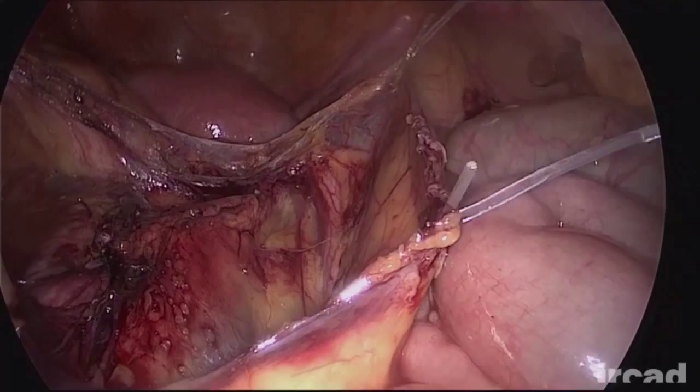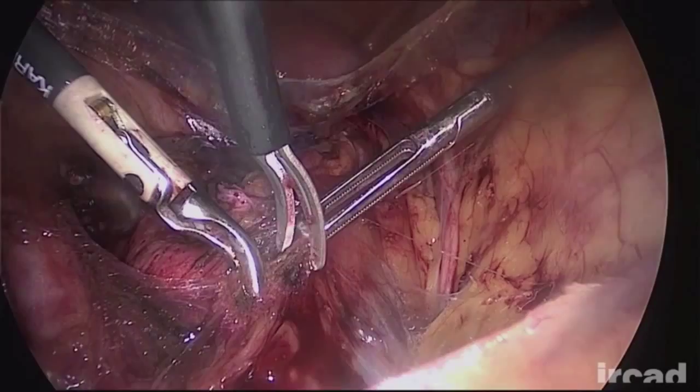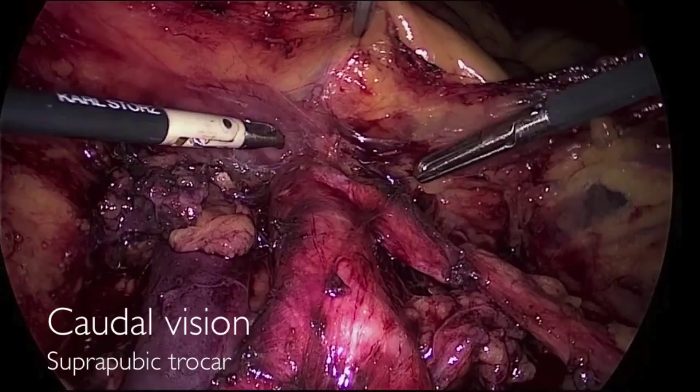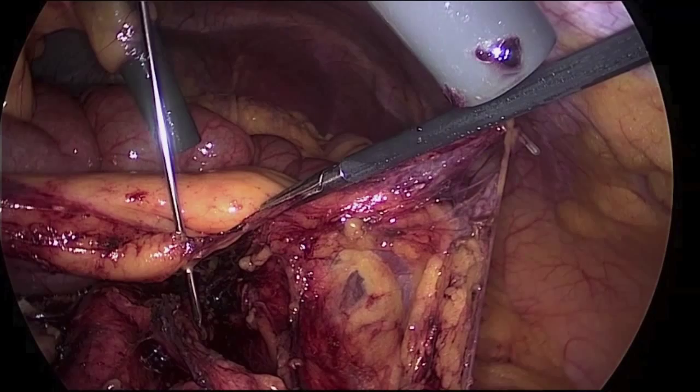The anatomy of the inframesenteric area is widely exposed and dissection can be pursued. The position of the camera is switched to the suprapubic trocar and the supramesenteric area is now dissected. A fifth suspension of the peritoneum is used at the cranial margin of the dissection. As a result, the third portion of the duodenum is lifted, improving the visualization of the left renal vein.